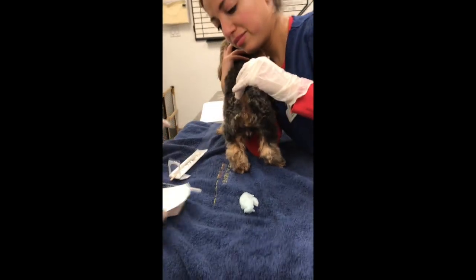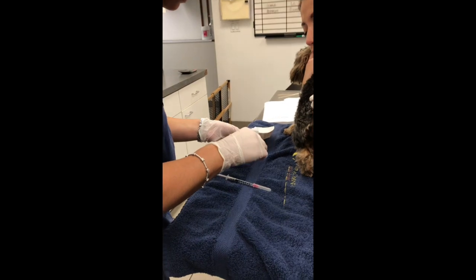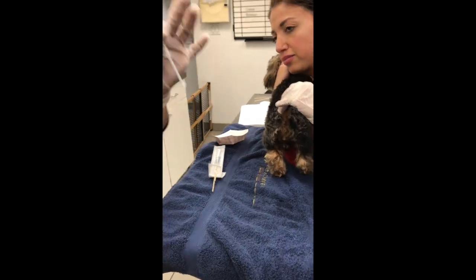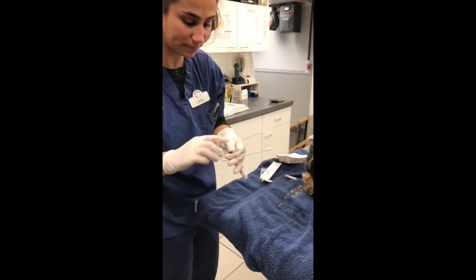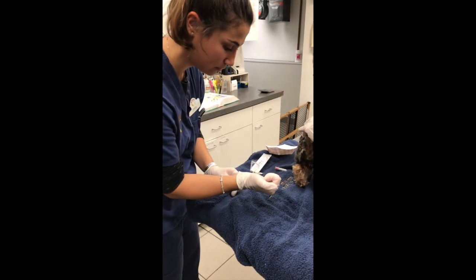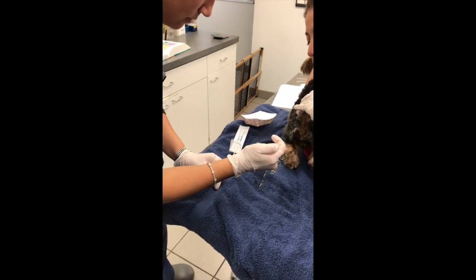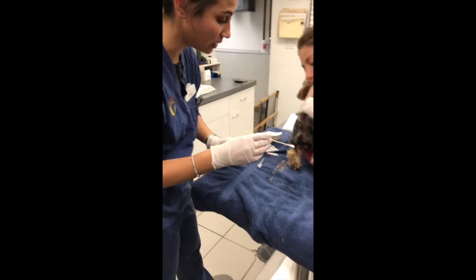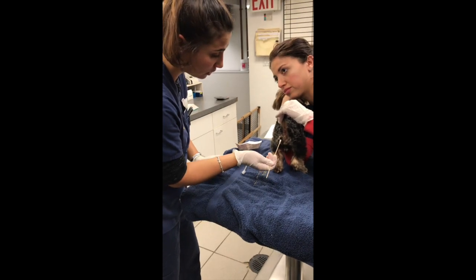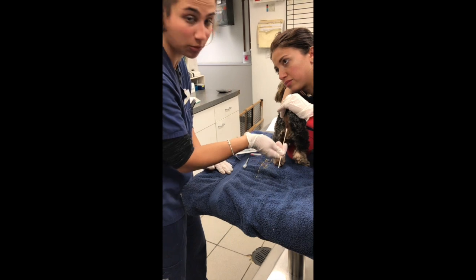Right, great. So now I have my sterile swab, and I also have sterile saline here. First I'm going to be moistening the swab with the saline. Now the angle I'm going to go in is a little higher than a 45-degree angle, and then I'm going to rotate and go a little more horizontal.